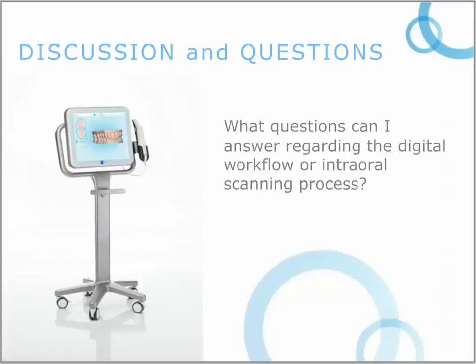Another thing is that we can make surgical guides, and the third thing is we can make provisionals. We now have materials that are FDA approved for use in the mouth, so we have now opened up the world of provisionalization, or making provisionals. Those three things I think will be common things that you'll see done on 3D printers in a doctor's office. Now back to your point. Buying a 3D printer at this point is not plug and play. It's going to take a little while for that to be made for dentistry.